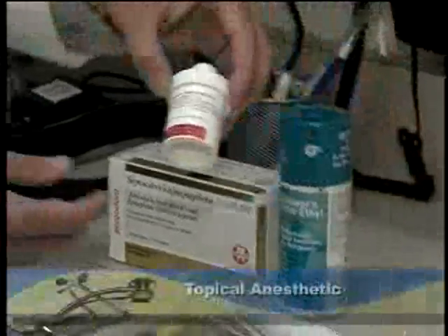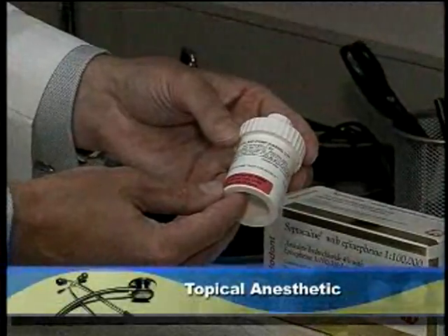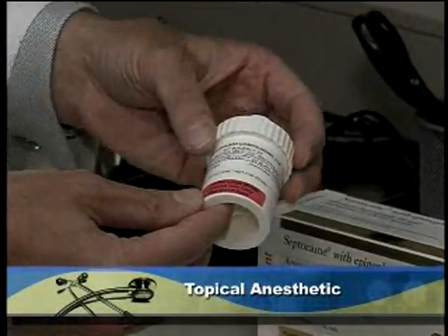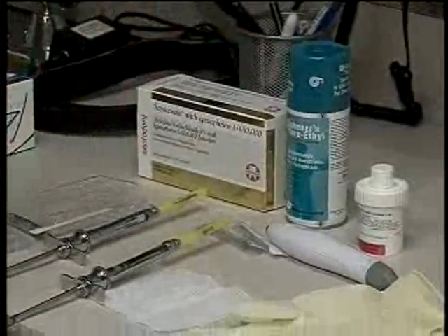We also use a topical anesthetic occasionally for tough to reach areas where we may place this on the skin and allow this to sit on the skin for 15 to 20 minutes and will help with some of the superficial discomforts of injecting, especially for injecting superficially.